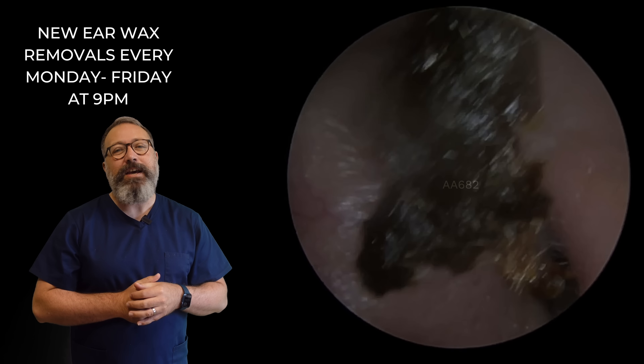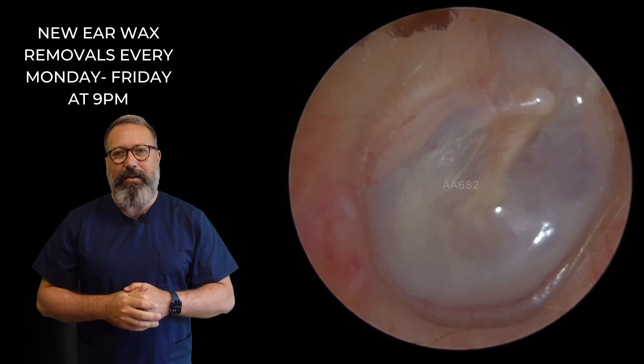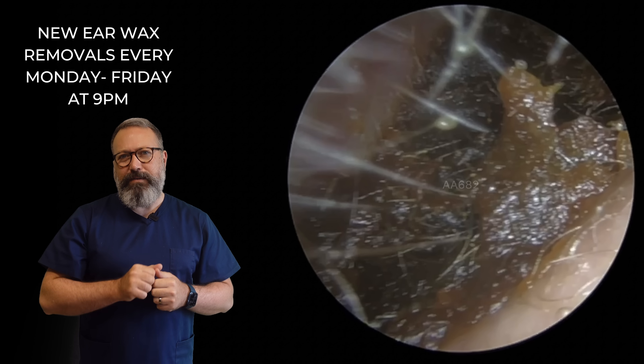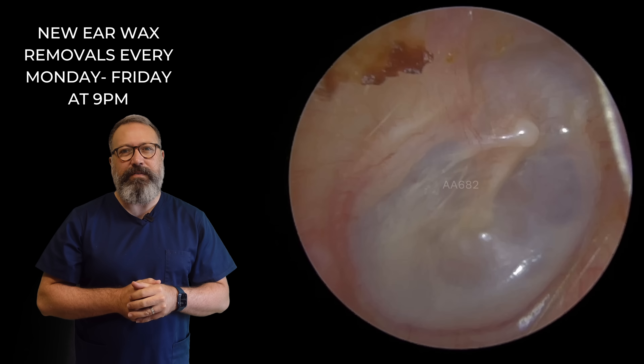Stay tuned guys — there is a second patient in this compilation as well. So there we go, eardrum looking lovely and healthy there. That's what it looked like beforehand and that's what it looks like afterwards. You can see a very, very different look in the ear canal.